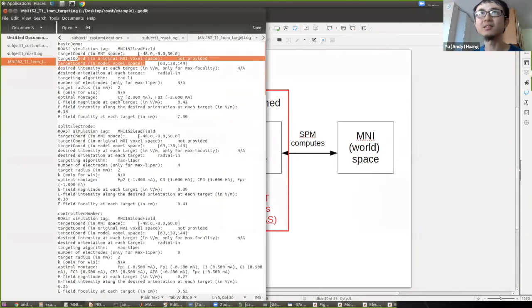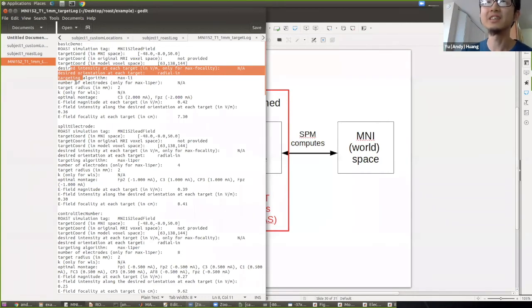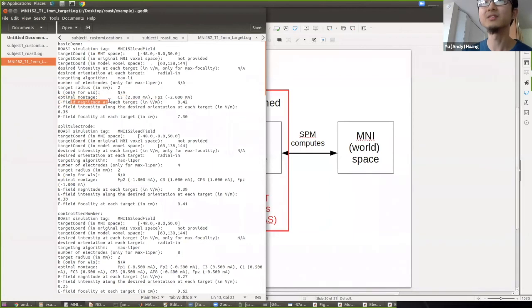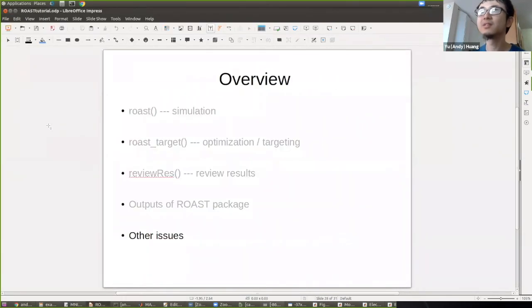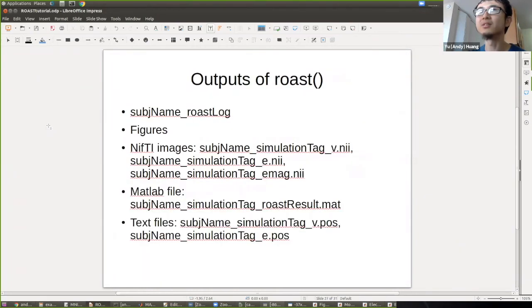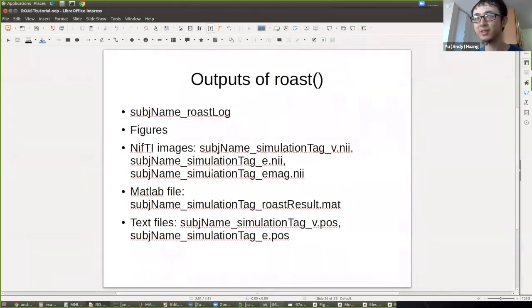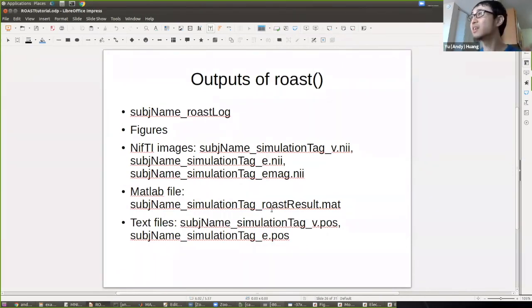The targeting log also records results such as the electric field magnitude at the target, electric field intensity along the desired direction, and focality at the target in centimeters. ROAST outputs results in NIfTI format — voltage and electric field — which can be loaded in other software. Everything is also saved as a MAT file. Loading the MAT file gives you the voltage as a matrix, electric field magnitude as a matrix, and the full 3D electric field as a 4D matrix (three components at each voxel).